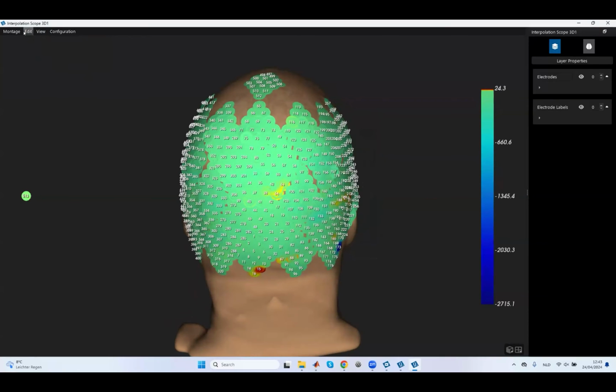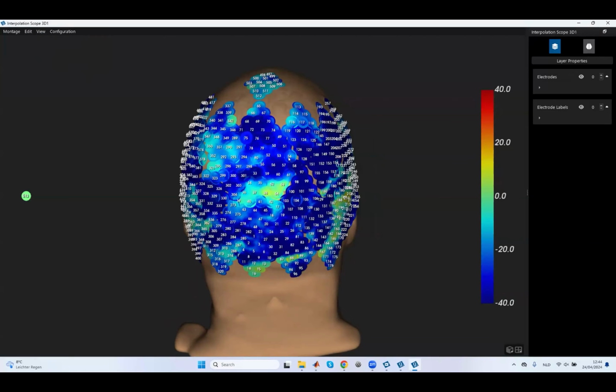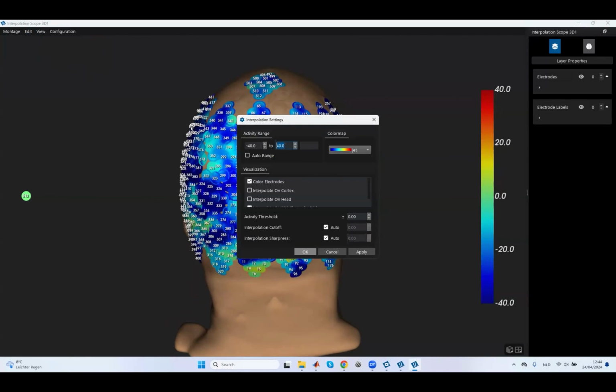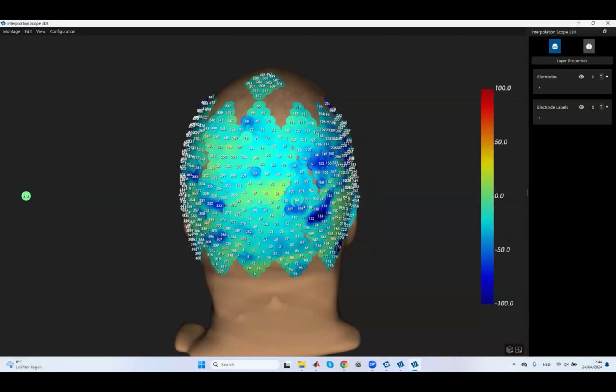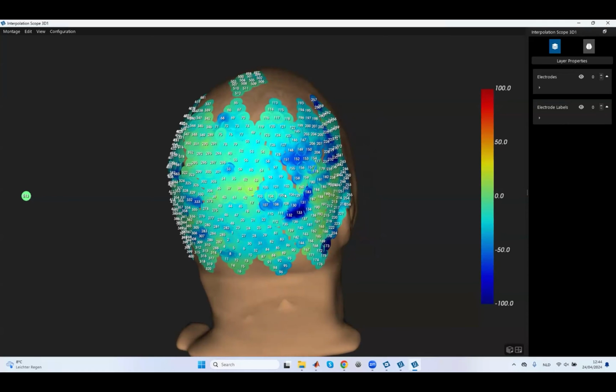I'm not sure what this question means, but in general the blocks we used for motor imagery were around 7 minutes, and the motor imagery task was around 2 to 3 seconds. And for some paradigms we used 5 seconds, if I'm remembering it correctly.